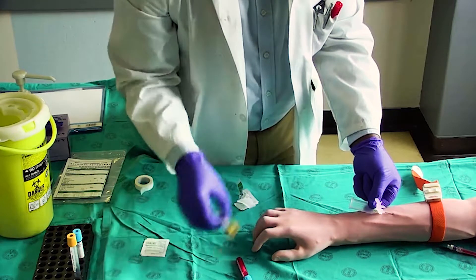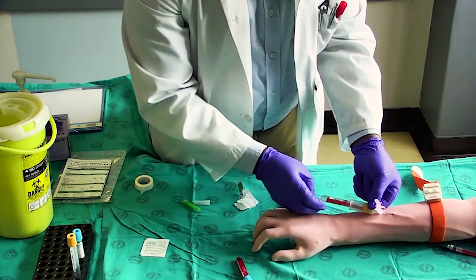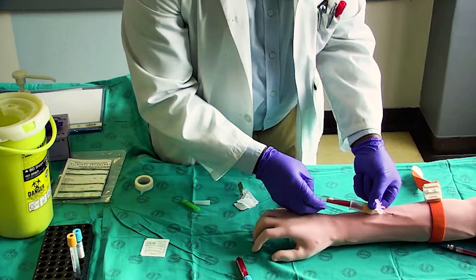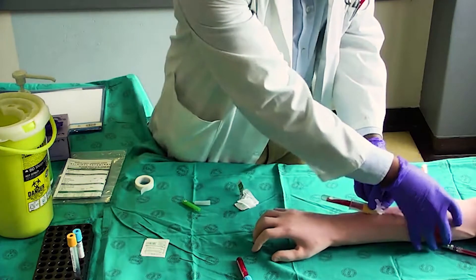If required, insert additional tubes for required tests. Release the tourniquet.